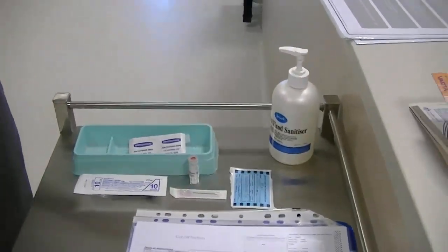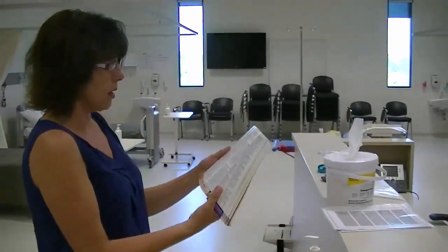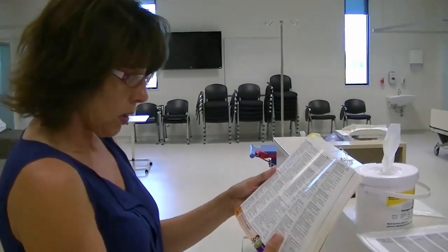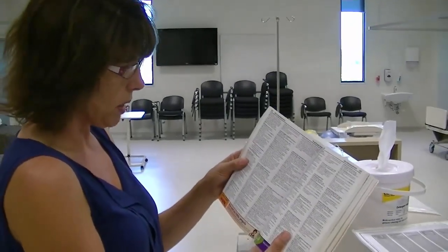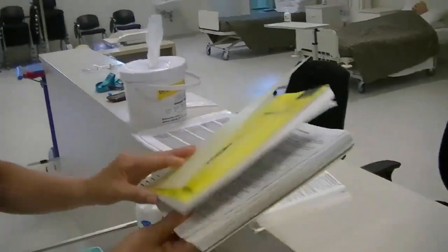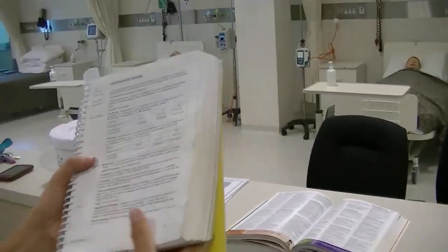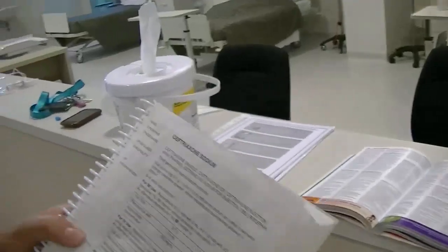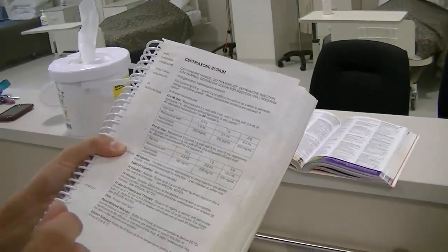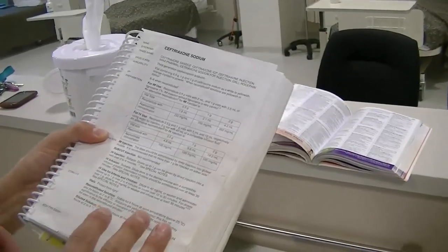Right, so now I'm going to look up my drug. I know I need to administer ceftriaxone, I need to know what it is, so I'll look it up in the MIMS or the drug book, and it will tell me that it's an antibiotic. The dose seems appropriate and I can administer by IV method. I'm going to look up my Australian Injectables Handbook and check how I can administer this. Now apparently Jessica has a bit of a reaction to a fast injection of a drug through the IV cannula, so I'm going to dilute it and put it into the burette so it runs a bit slower.